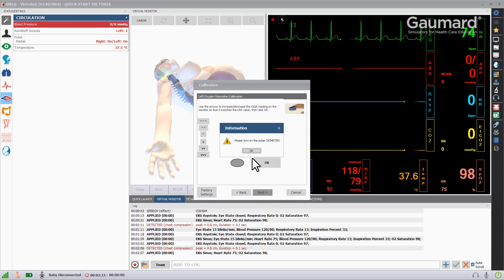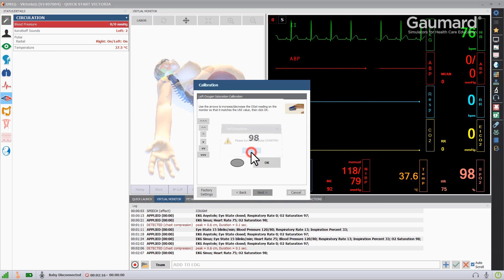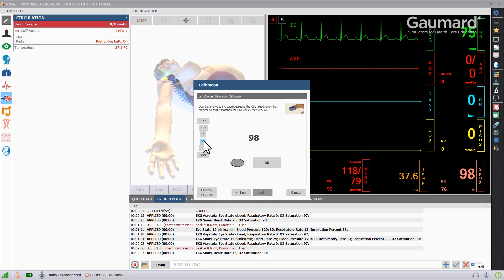When prompted by the software, turn on the oximeter. Press the up or down button until the number on the oximeter matches the number in the software.